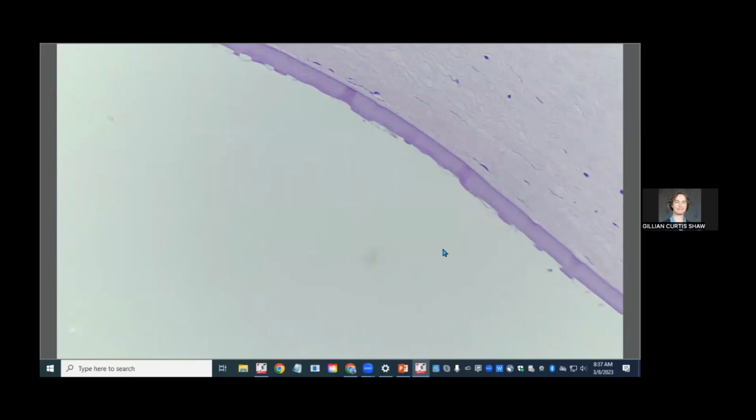Are there any breeds or species that you think of when you're talking about this? Boston Terriers. It's more commonly seen in dogs, I think. Yeah, Boston Terriers. But for us, we rarely get to see them on histopathology because it's a clinical diagnosis and it's not painful.